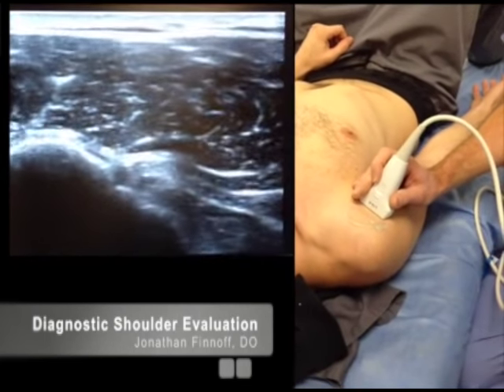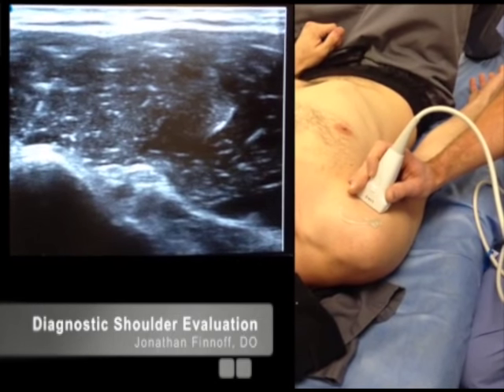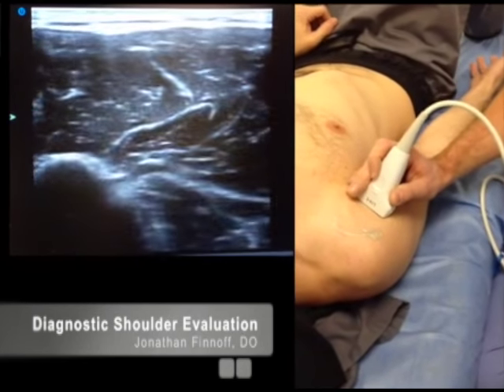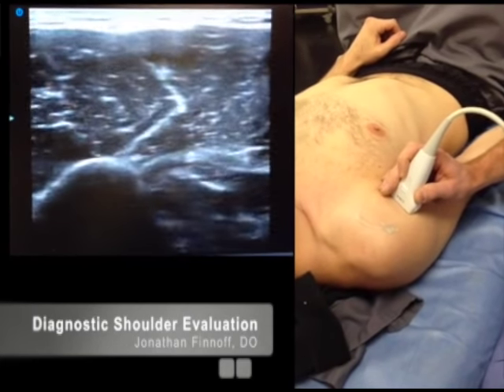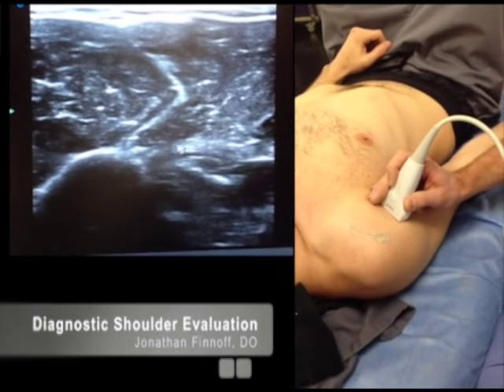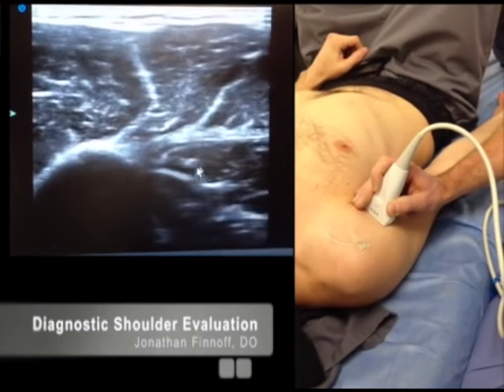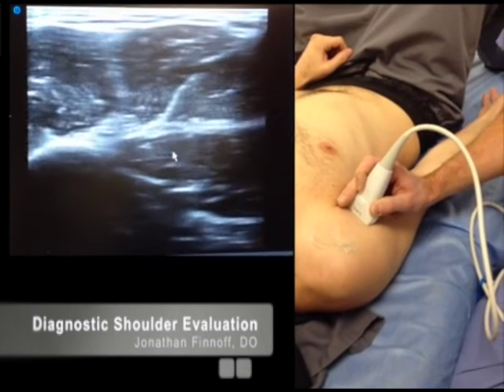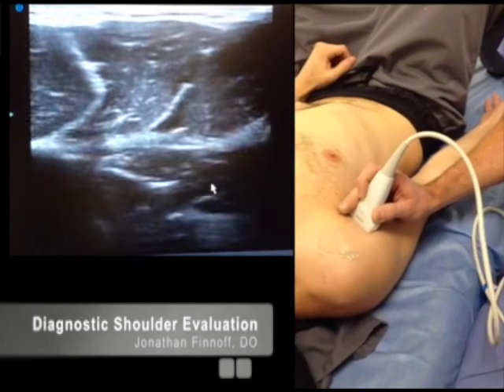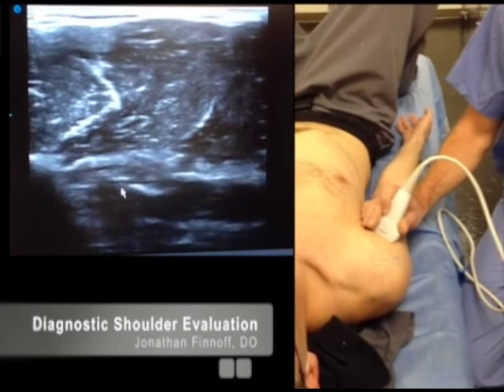I'm going to scan down distally. As I scan distally, the biceps tendon is going to be diving deeper, so I have to wag the transducer to eliminate anisotropy. I'll change the depth to ensure I can still see all relevant structures. Now we have the pec tendon coming in from the right, going across to the left and attaching to the humerus. At that area, we have the musculotendinous junction of the long head of the biceps. Here's the long head, next to it is the short head, and deep to them is the coracobrachialis. Always scan down to that musculotendinous junction.